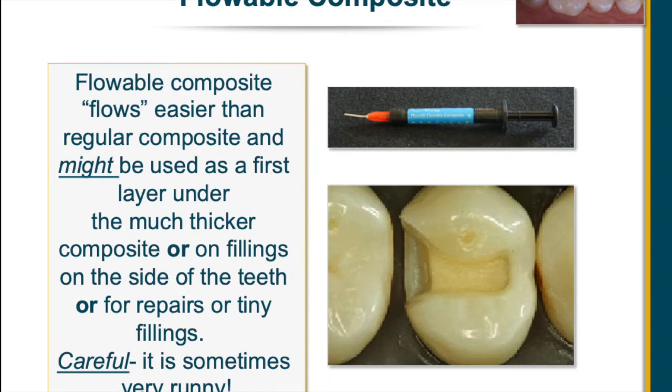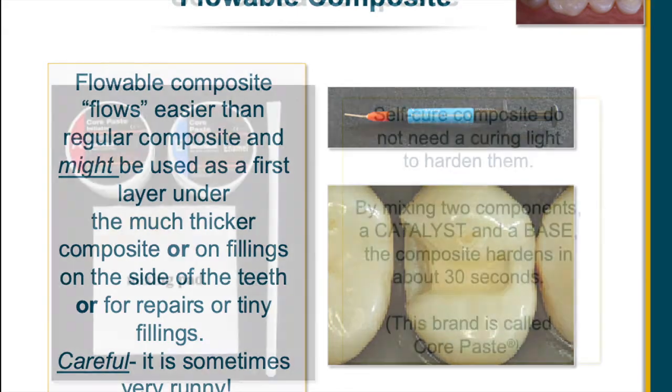There is such a thing called flowable composite. Rather than being putty-like, this is more liquid-like. So it flows easier, and it might be used underneath as a first layer. I personally don't recommend that, but some dentists might be doing that. So you just need to be aware that's a possibility. You also need to know that it's very runny, so it can squirt all over the place, so be careful with it.